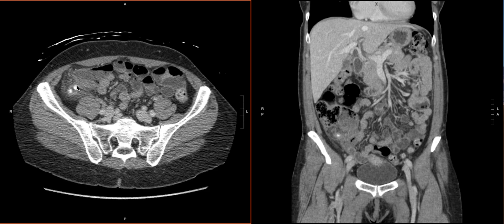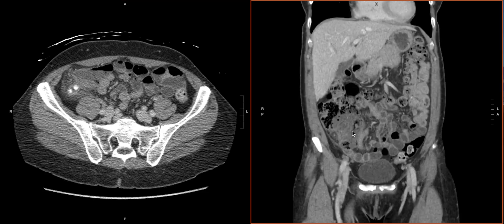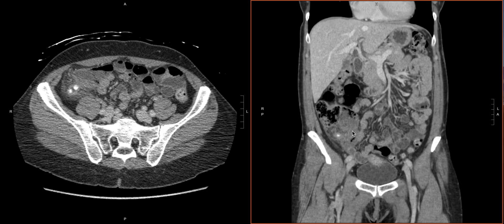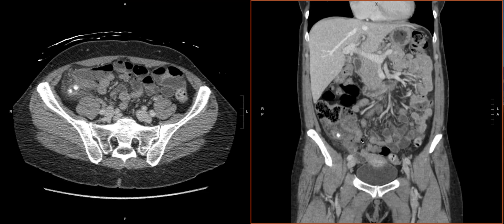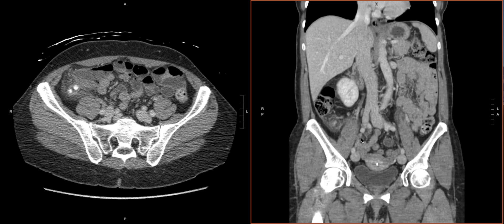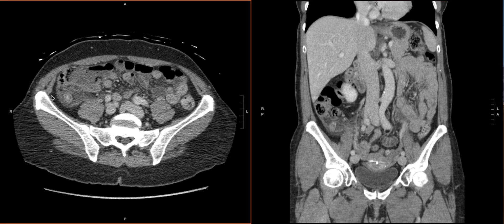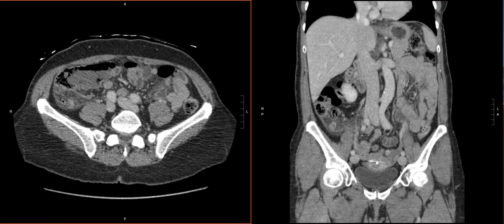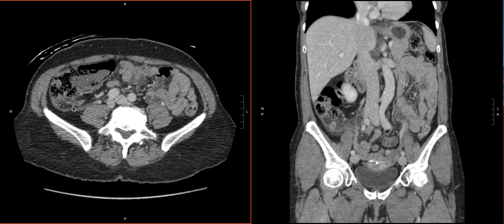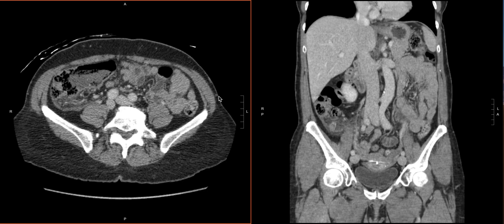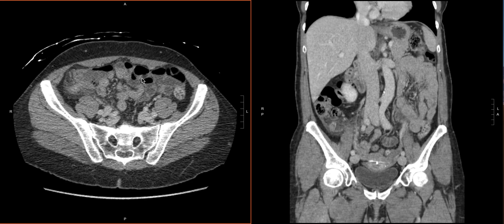Now that we know we're dealing with the appendix, we can look on the coronal as well. There it is coming off the cecum and going over here. We just want to confirm: is this blind ending? And as we go through — yes, it is. So it's blind ending; there's the tip, kind of pointing up, not quite all the way to the liver, but pointing up towards the liver. So we've found the blind-ending appendix.